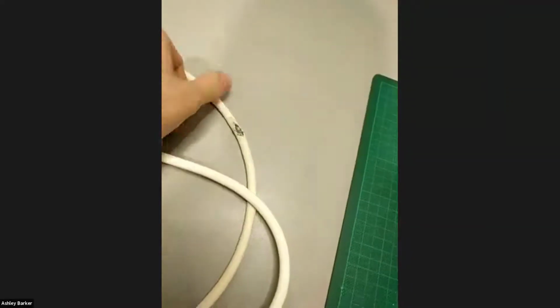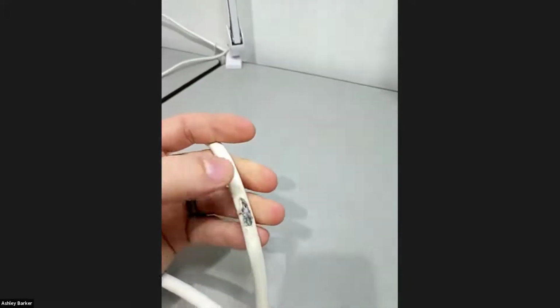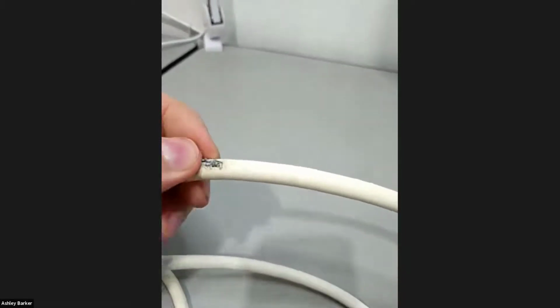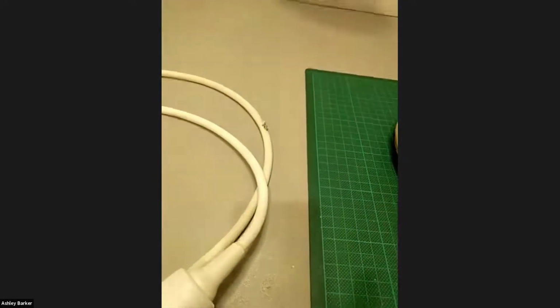So another common one that you see all of the time is wheels of the machine scuffing the cables. And it's so manageable, just make sure that your cables are hooked up on the hooks. Obviously things do fall down and people are busy, but it's just such a shame when they get all scuffed through just from the wheels. But it's also worth checking your probes and seeing if that's the case and dealing with it if it is.